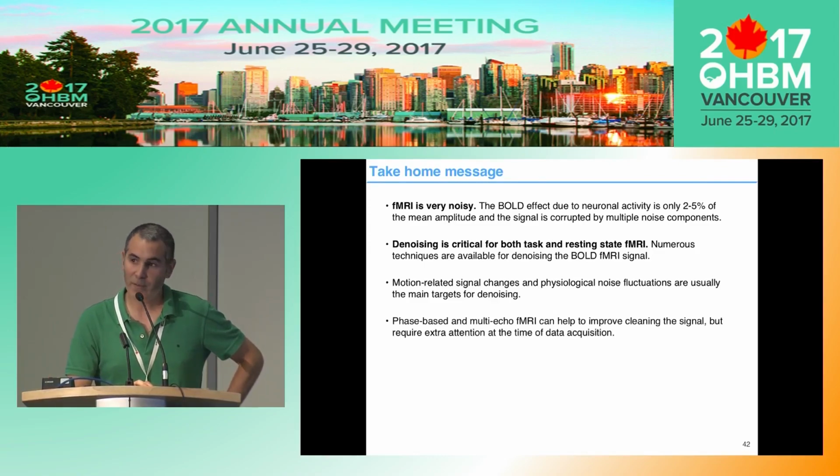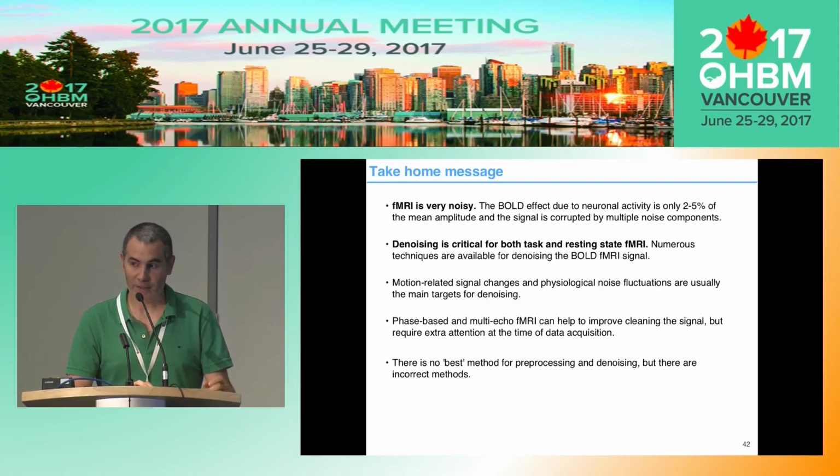But you can actually improve the denoising by adapting a little bit your acquisition and, for instance, recording the phase of the signal or using multi-echo fMRI. But it's very important to realize also that there is no best method for pre-processing or for denoising. And it's very important to do things in the right way.